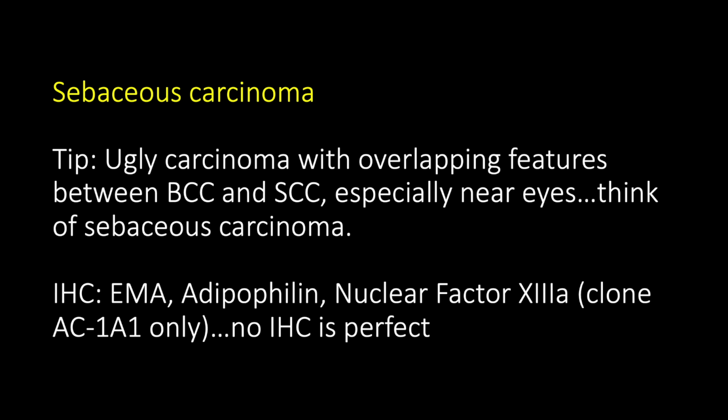Now the problem is this. Some tumors are obviously sebaceous, but you have a hard time telling are they benign or malignant. Other tumors are obviously malignant, but you have a hard time telling, are these vacuoles enough to call it sebaceous, or is that just some artifactual vacuolation in a squame or a basal, which, by the way, I see all the time, unfortunately. So I've written papers about this, and I should know how to do this, but I still struggle with this a lot in practice. I think they're very difficult sometimes to be sure if there's sebaceous differentiation in a carcinoma.